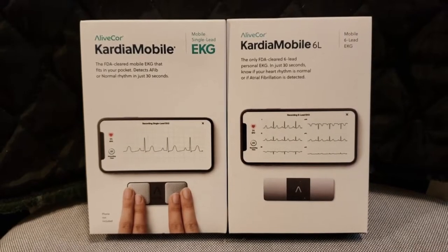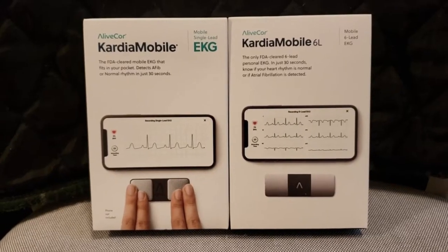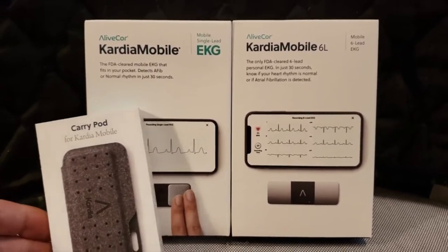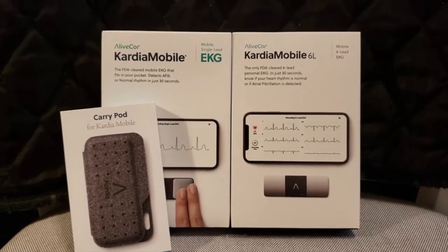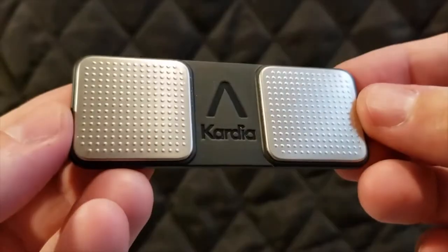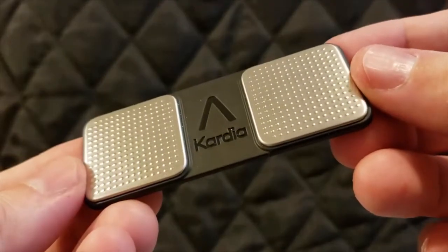Hey everyone, Leo Bond here. I'm back again today for the Best Buy Canada blog, and this time I've got what you could say is a double review — maybe even a triple review — because I've got two Kardia Mobile EKG monitors and also a carrying pod for one of them. The first monitor is called the Kardia Mobile Personal EKG Monitor, and the second one is called the Alive Core Kardia Mobile 6L Portable EKG Monitor.